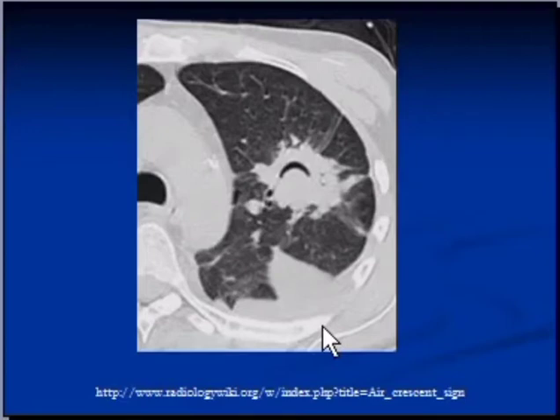If you were to do a biopsy and look at the specimen microscopically, such cavities will have mucus, fibrin, necrotic tissue and cell debris. Presence of air is the result of phagocytosis from white blood cells, which create a space towards the edge of the cavity. This space is occupied by air to create an air crescent sign.